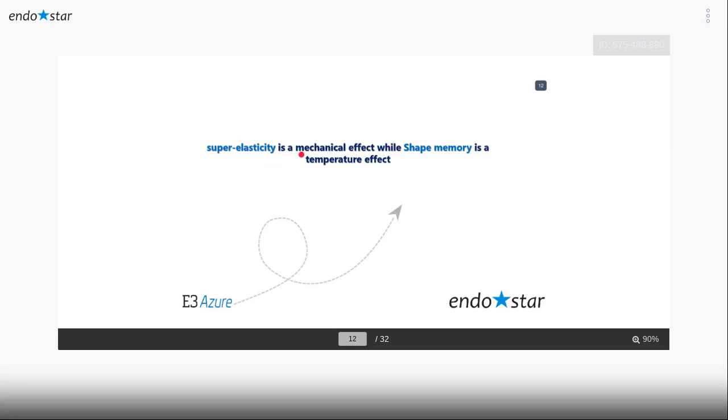Pseudo elasticity means when you remove the force from the file, it wants to return back to the original shape, not by temperature, not by anything. So this property makes the file a little bit tough and strong, but at the same time you cannot use it in all cases. But with shape memory, you can pre-curve it and make it according to your case.